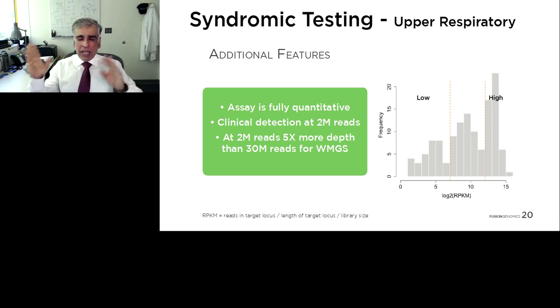So without looking at anything else, the assay can instantly quantify an infection into these categories. And yes, it can provide you your IU/mL and everything, but it can also give you a complete overview of, based on all the samples that have been tested, where this sample stacks up in terms of the quantity that is present.